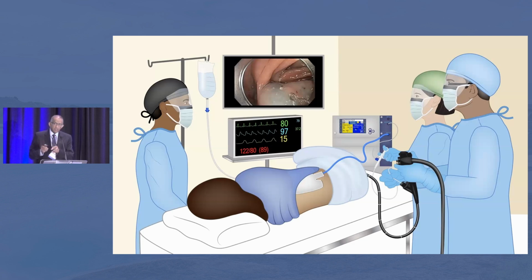So to achieve that, make sure that your electrosurgery unit is in front of you and your assistant tells you what settings are being delivered. If you don't do that, you may be delivering a current somebody has set and probably not the current for that patient.